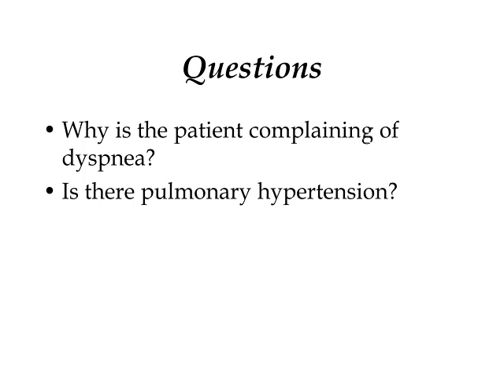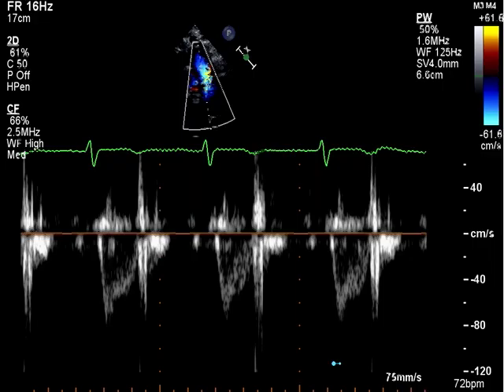Now you may say, well, look, the ventricle has poor systolic function. The deceleration time through the mitral valve is short. They're probably in heart failure. That's a very good educated guess. Can we do any more to quantify this? Can we prove it? Well, here's the pulmonic valve pulse wave Doppler. This is an image that I showed earlier, and I said, look at it carefully.